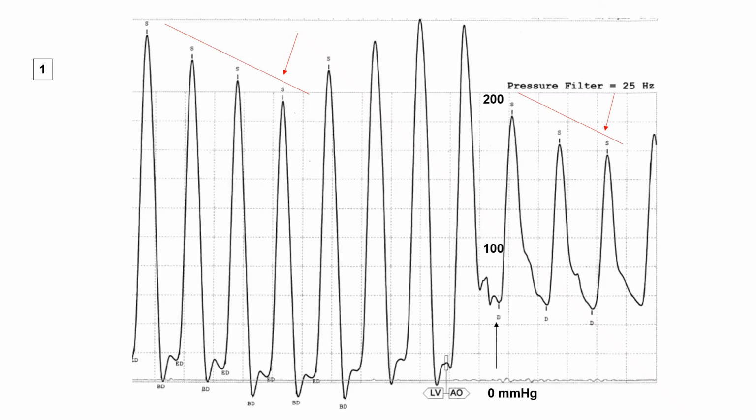It is useful in cases of unsuspected AS, where your peak-to-peak pullback gradient comes up less than 10 to 15 millimeters of mercury. In this case, you rule out severe AS. And it is also useful when the gradient is very high, over 40 millimeters of mercury. It is not useful whenever your peak-to-peak gradient is somewhere between 15 to 40. It's not useful to assess aortic stenosis. And that happens to be the case of most aortic stenosis we like to assess invasively. So it's really essentially useful to rule out aortic stenosis. It's not useful to make accurate measurements.